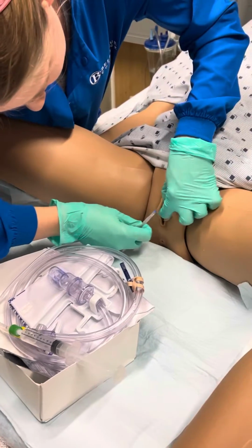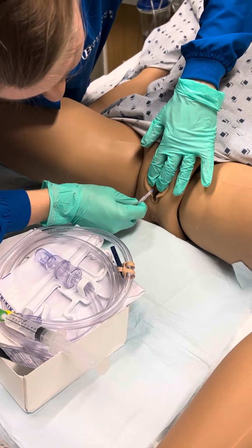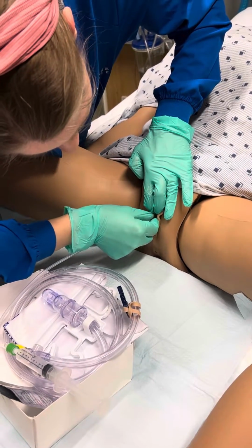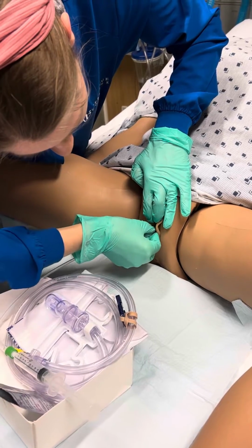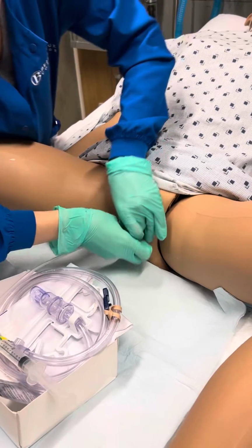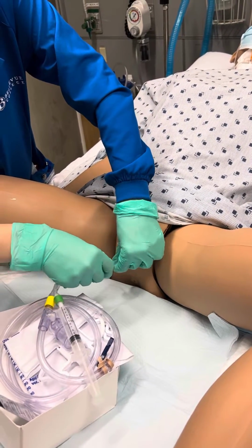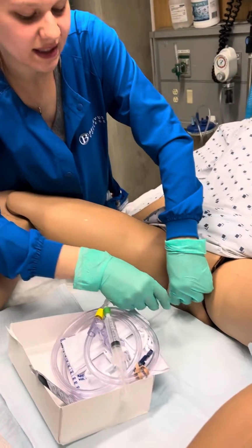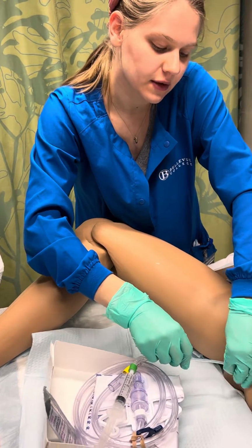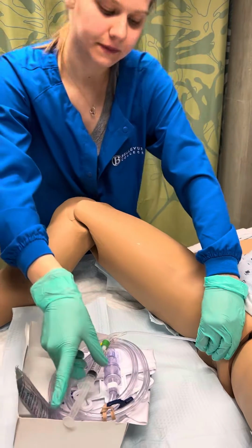So I'm going to spread the labia with my non-sterile glove and insert the catheter into the urethral meatus. And once I see the flow of urine, I'm going to advance another 2 inches for my female patient. For a male patient, I would advance the catheter all the way up to the bifurcation.